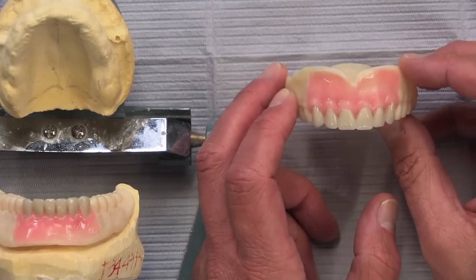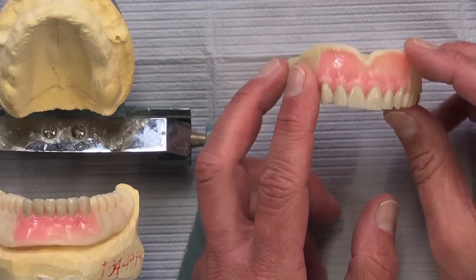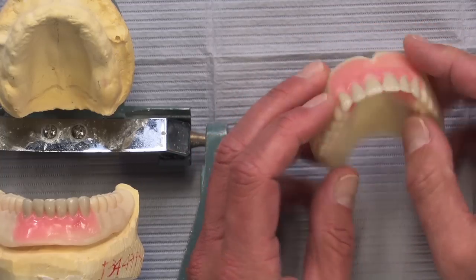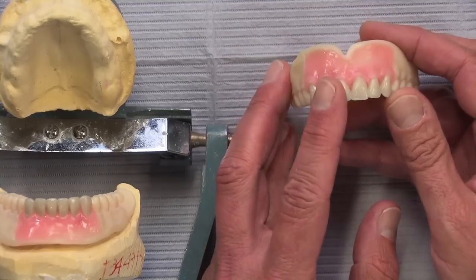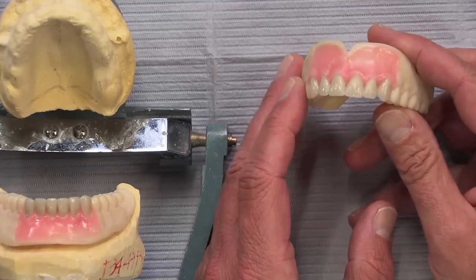After the very first appointment you'll be able to see the fit right away. Before, with the wax rims, they would flutter all over and sometimes we'd have to put denture adhesive in, which was a mess. On our old bite rims we would just put the two central incisors there, but with CAD-CAM we have the opportunity to do a little bit more.